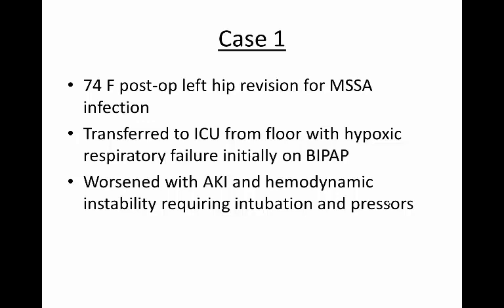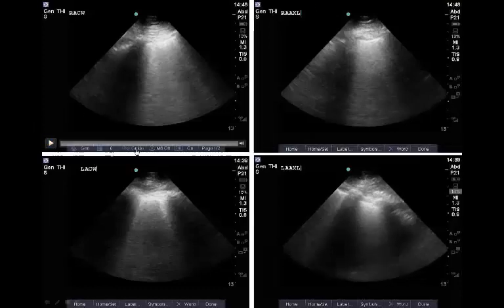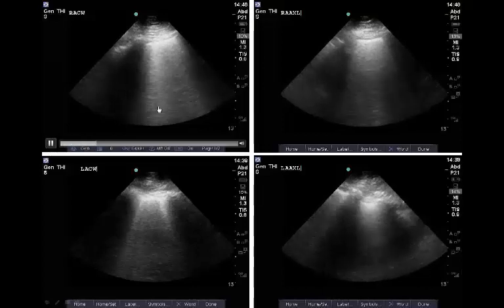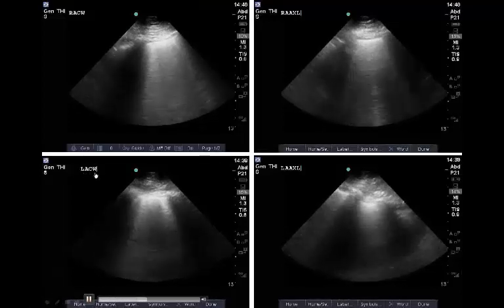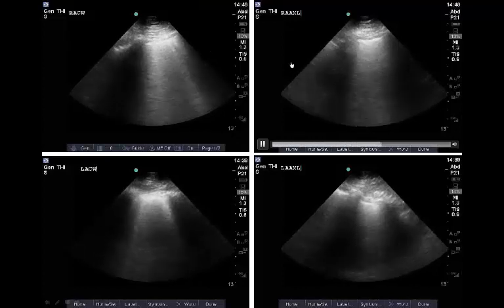The first case is a 74-year-old lady who was post-op after a left hip revision for methicillin-sensitive staph aureus infection of the hip. She was initially on the floor after her surgery but was transferred to the ICU with hypoxic respiratory failure, initially requiring BiPAP. She gradually worsened and developed acute kidney injury and became hemodynamically unstable, requiring intubation and pressors. Her chest x-ray demonstrated extensive bilateral airspace opacities. Thoracic ultrasound was performed, with views from several different locations across the chest wall, including the right anterior chest wall, right anterior axillary line, left anterior chest wall, and left anterior axillary line. In all these views, diffuse b-lines are seen throughout, suggesting diffuse parenchymal disease.